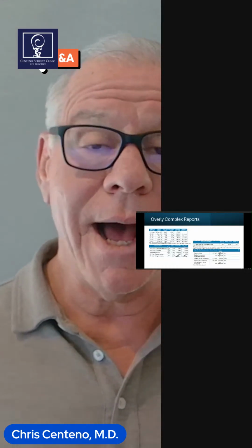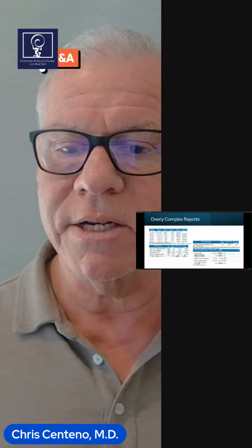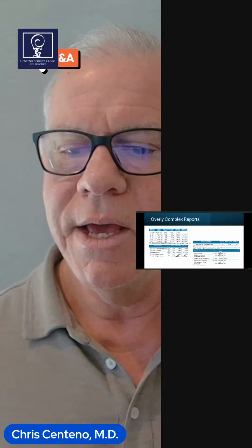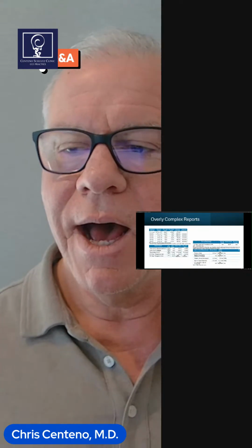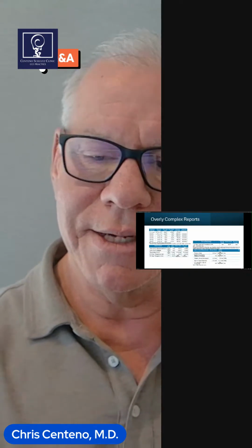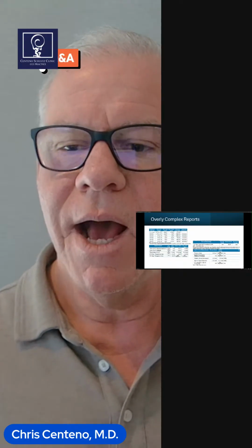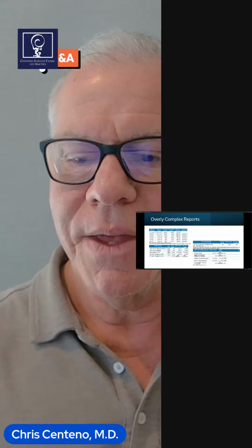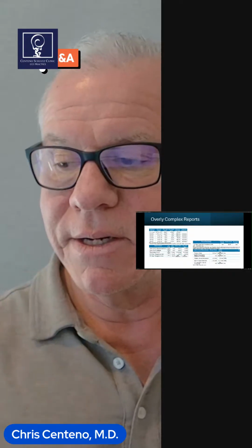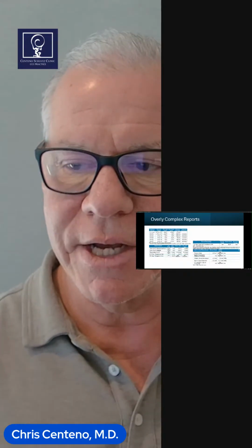And then we get into overly complex reports. These don't drive me as crazy as the damage reports, but these can be very daunting to look at for a patient, right? You've got all these numbers, all these different values. Here we're measuring on the top left, or off on the left, we're measuring segmental movement. That's being measured both angular there. In other parts of reports like this, it's measuring translation.